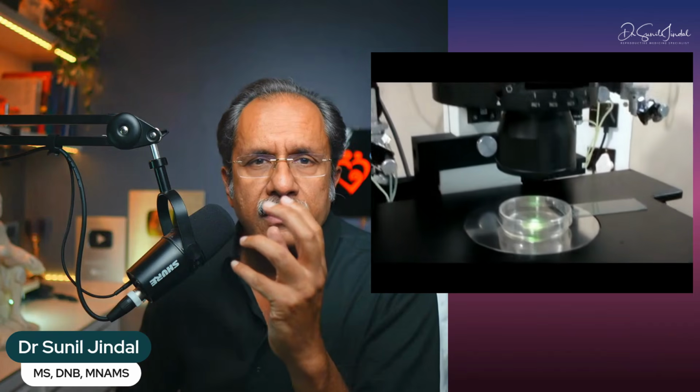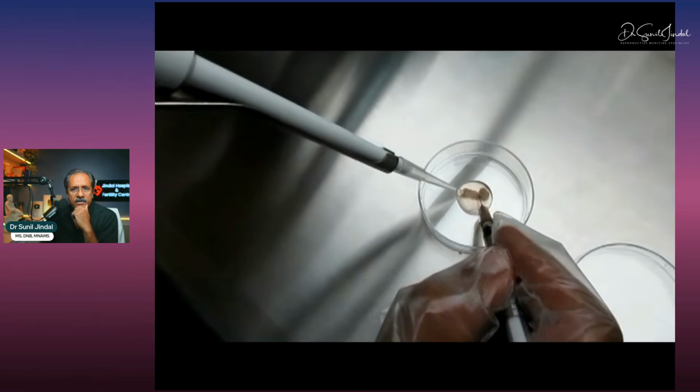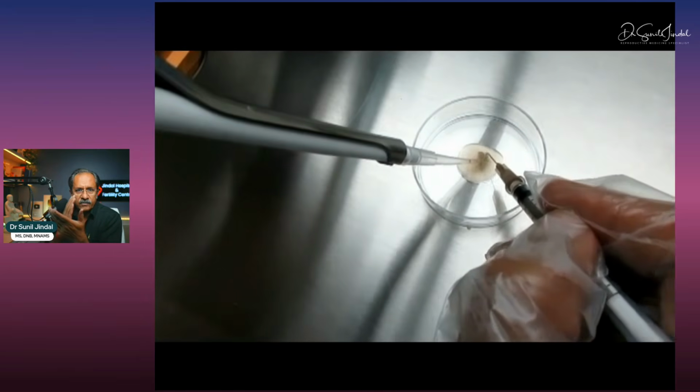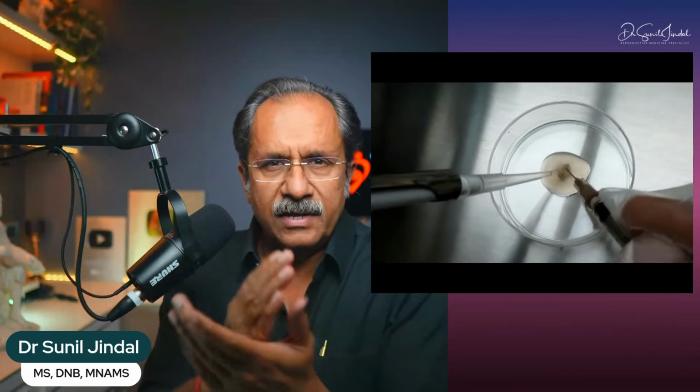So when we take this under a microscope, this is how it appears to be. And when we see this under a microscope, we're going to find sperms in this. Now let me show you a micro-TESE sample. So this is a sample which we have. We are cutting and mincing this sample. We are chopping it slowly, doing it to a level that we have very, very small areas.